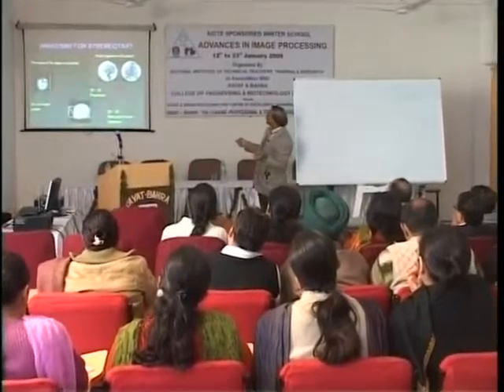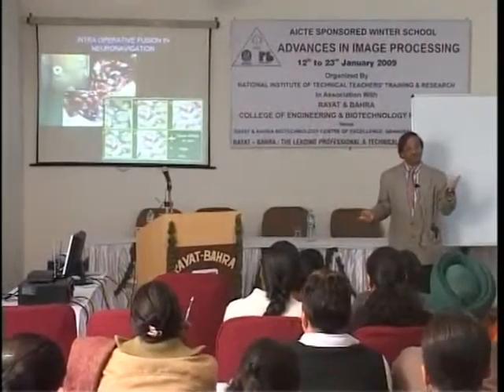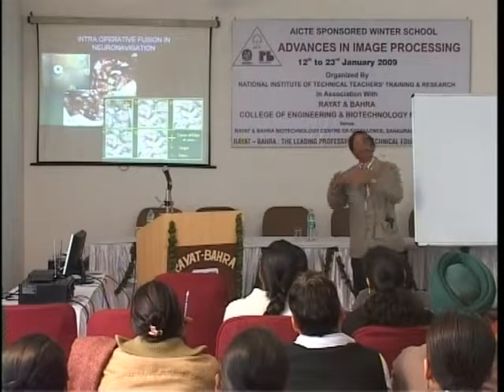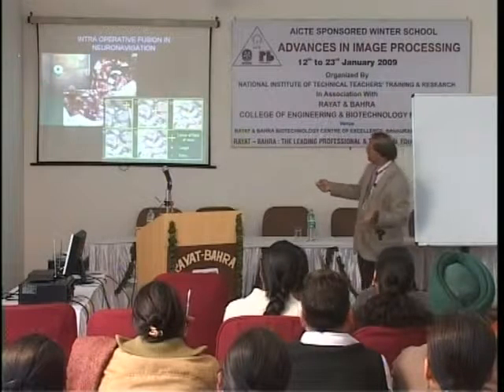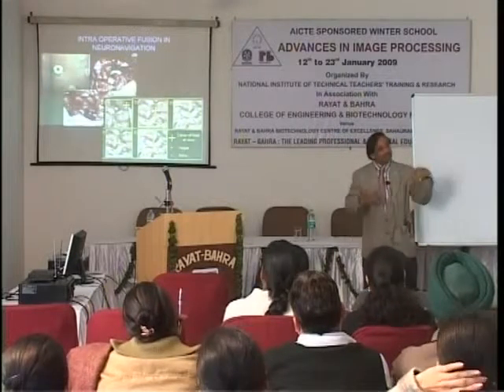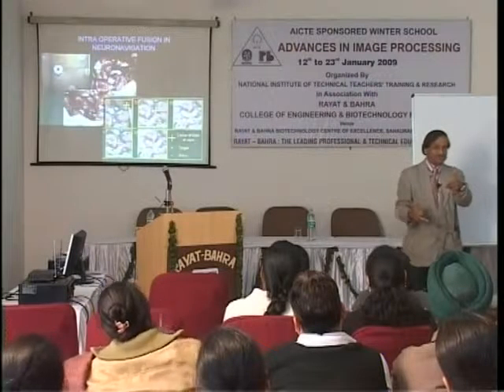Next. And of course, now what is navigation? You are navigating as if you are doing virtual surgery. That means you open the brain and you don't see the lesion. You have already acquired the data set, and you know your XYZ axis, you know the depth, you know where exactly it should go.